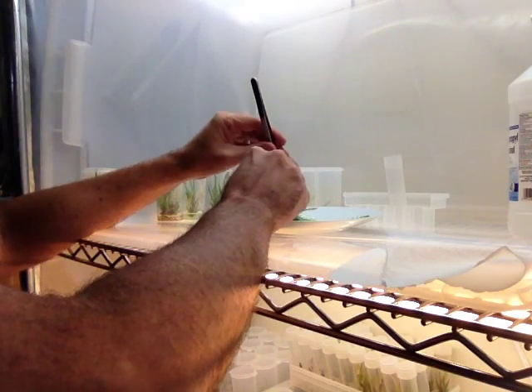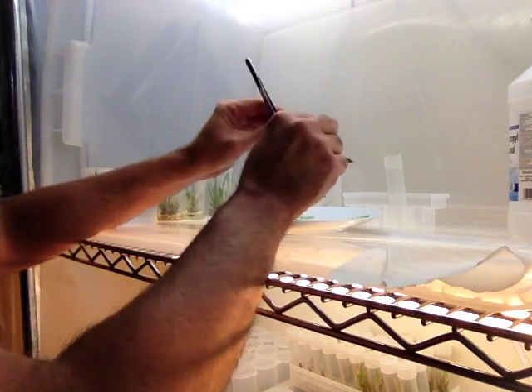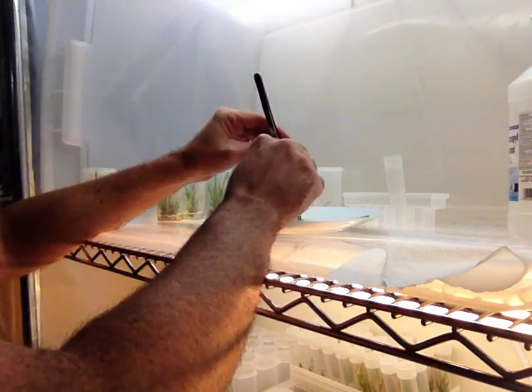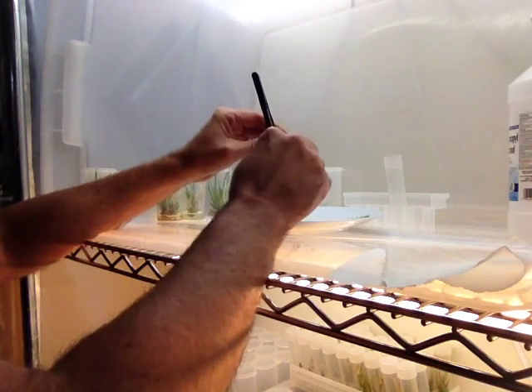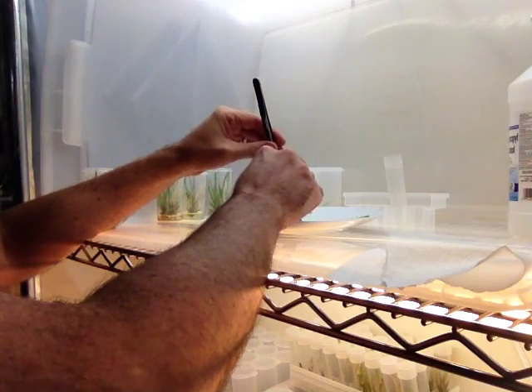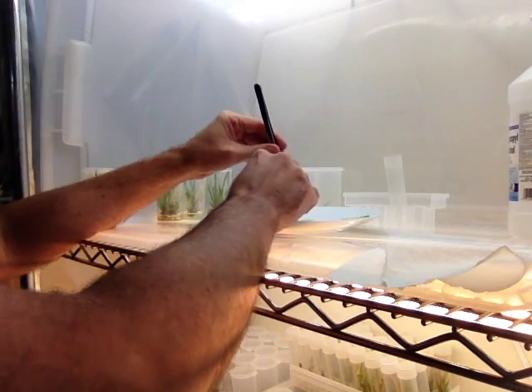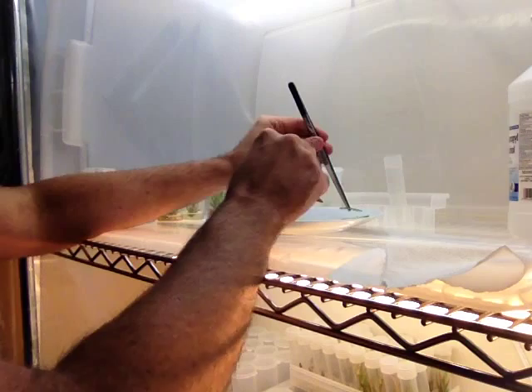Yeast is sort of more irritating and we've got preservatives in the mix to keep that from happening. But once in a while the yeast gets a little overpowering and it'll grow where it wants to grow. We're going to use the preservatives to help keep them down.